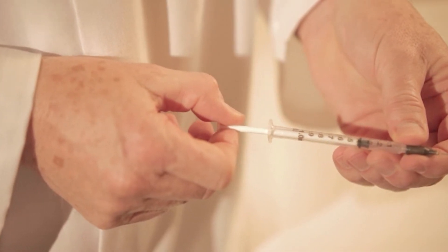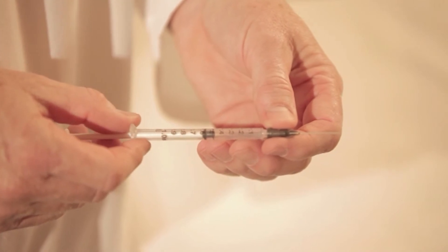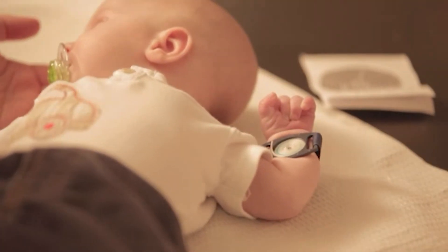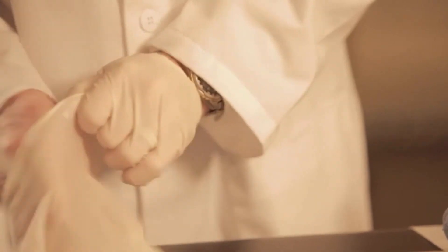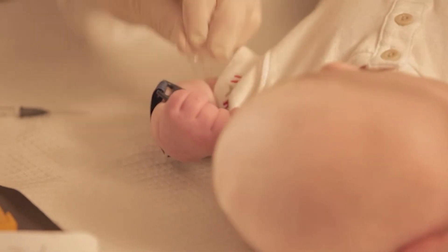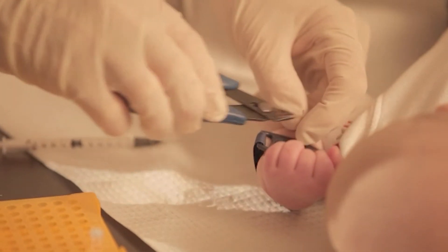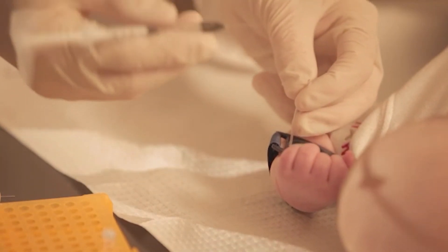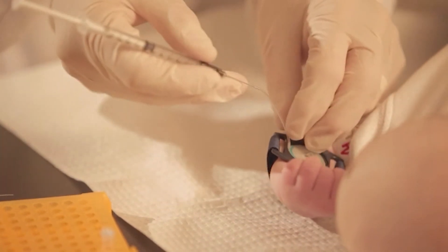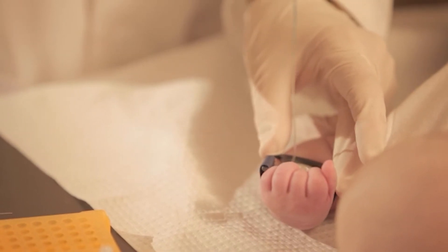If the person fills the macro duct collector before 30 minutes, the timer can be shut off and you may remove the sweat immediately. Attach a one cc syringe to a blunt needle, or use the sweat dispenser. If using a syringe, pull the syringe back to 0.5 milliliters. Leave the macro duct collector firmly attached to the skin. Put on gloves, remove the protective transparent cover by inserting the pointed tip of the nipper into one of the cut-out sections and prying upward. Use the tip of the nipper to lift the outer end of the collector coil and insert the blunt needle two to three millimeters into the free end of the tubing.